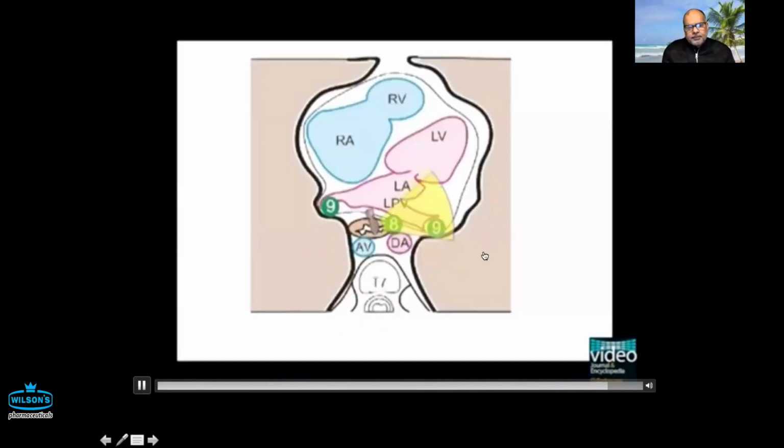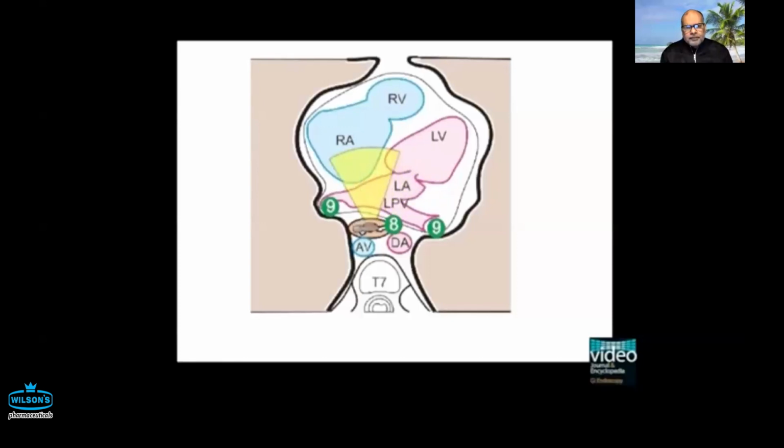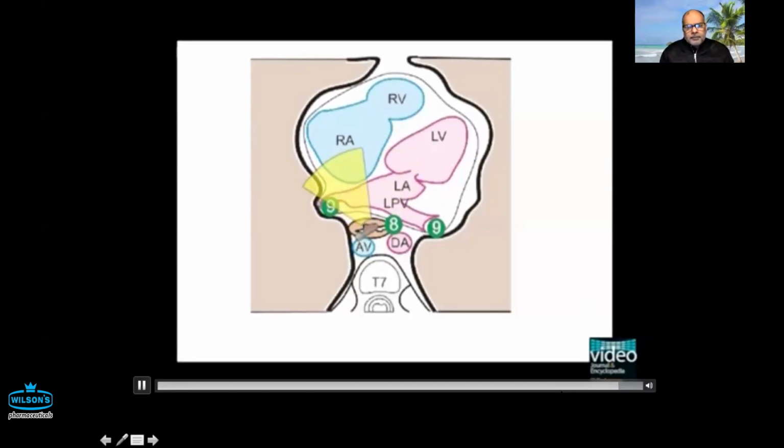The mediastinal structures during rotation at 33 centimeters show the left atrium as a large pulsatile chamber at the lower limit of the subcarinal area. With a clockwise rotation and withdrawal, the aortic outflow tract, aortic valve, and ascending aorta can be visualized through the left atrium.